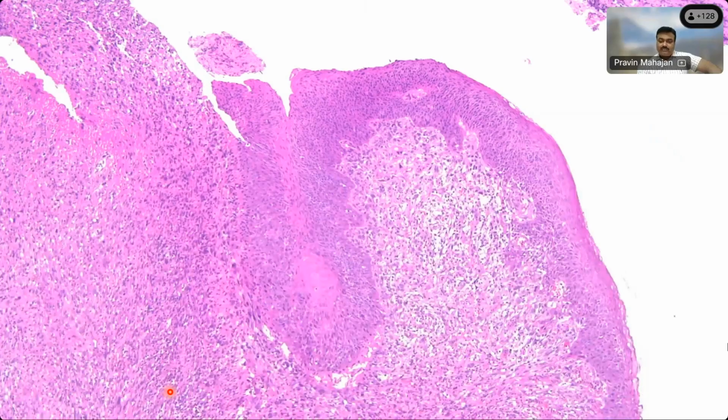So we know that we are dealing with a very malignant tumor, having a spindle cell morphology, having a lot of nuclear pleomorphism. And in one area, it also showed a surface epithelium which was intact. And this surface epithelium now looks quite different. If you compare this area with this area, here it looks like there is a lot of crowding of the nuclei, very haphazard, with loss of polarity.